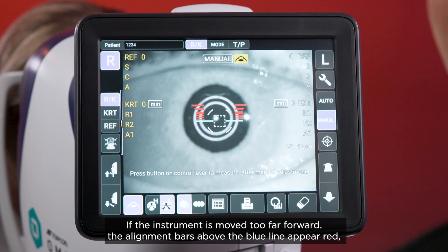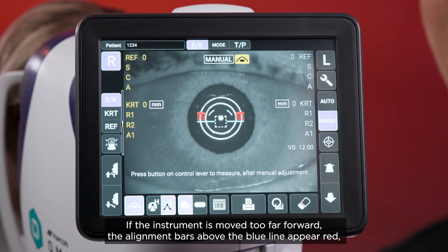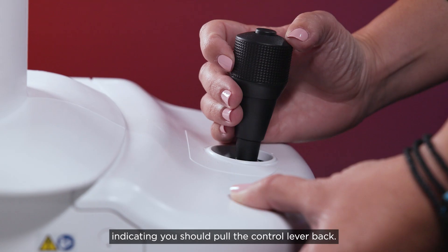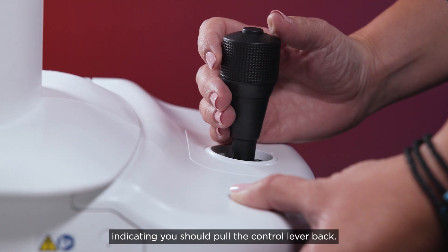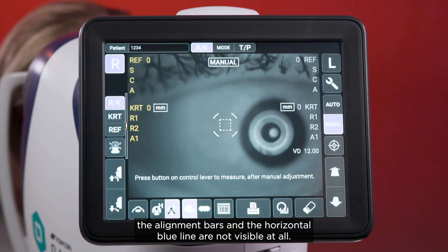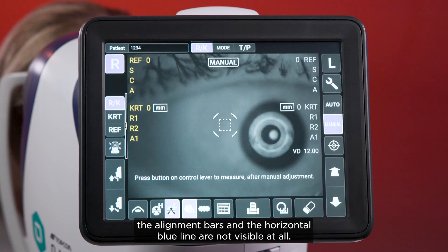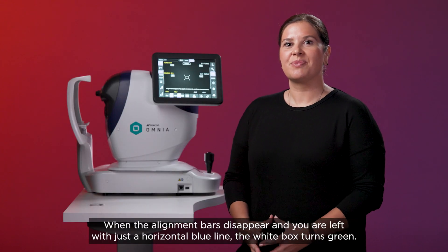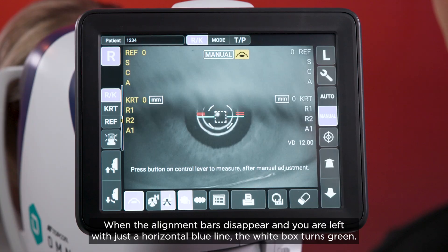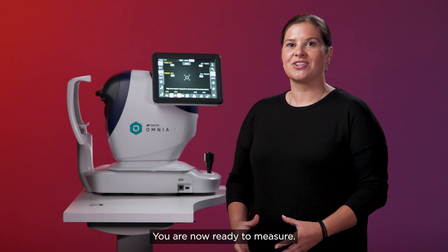If the instrument is moved too far forward, the alignment bars above the blue line appear red, indicating you should pull the control lever back. If the instrument is completely out of alignment range, the alignment bars and the horizontal blue line are not visible at all. When the alignment bars disappear and you are left with just a horizontal blue line, the white box turns green. You are now ready to measure.